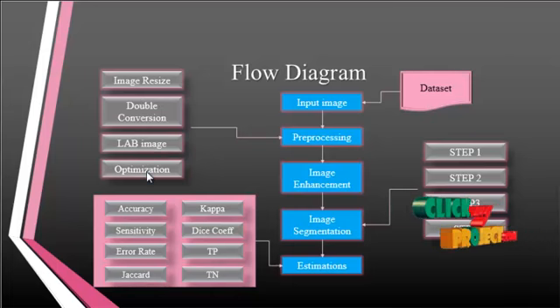Then the optimization is also carried out in the pre-processing step. After the optimization, we get the enhanced image.